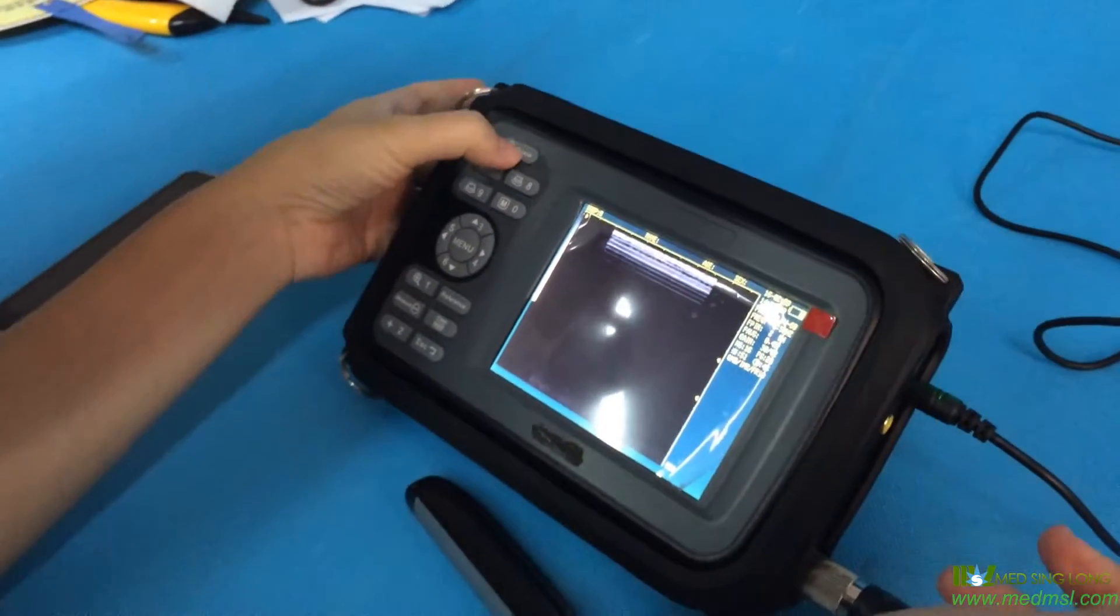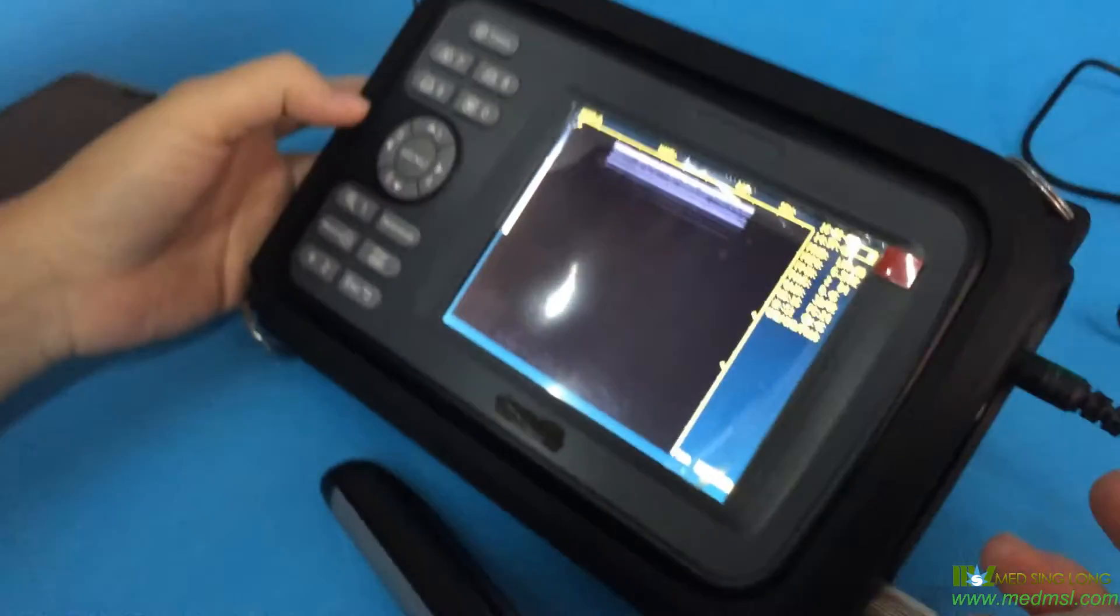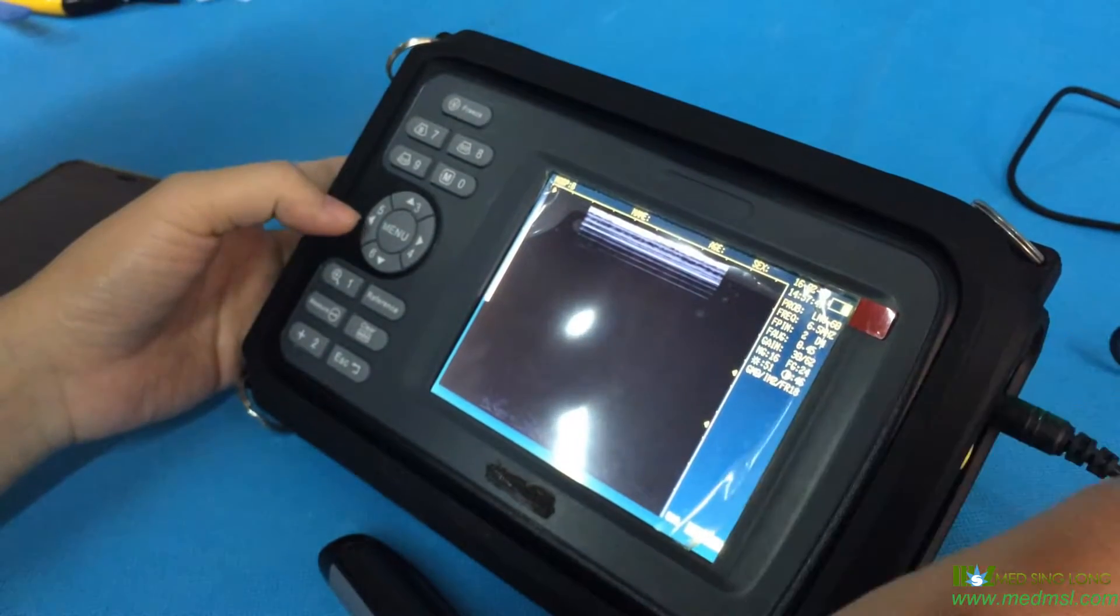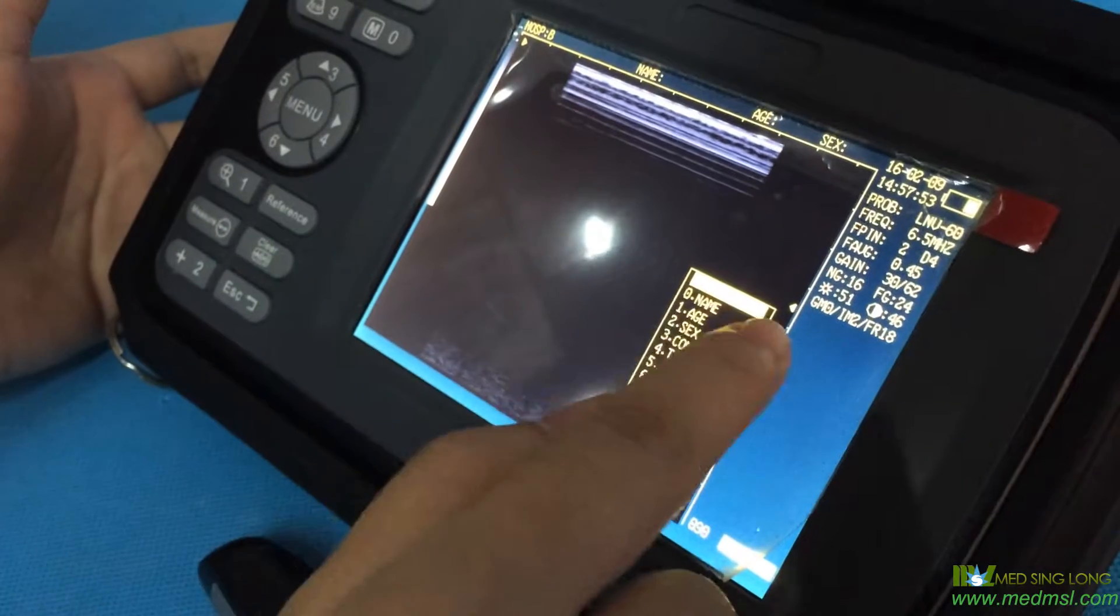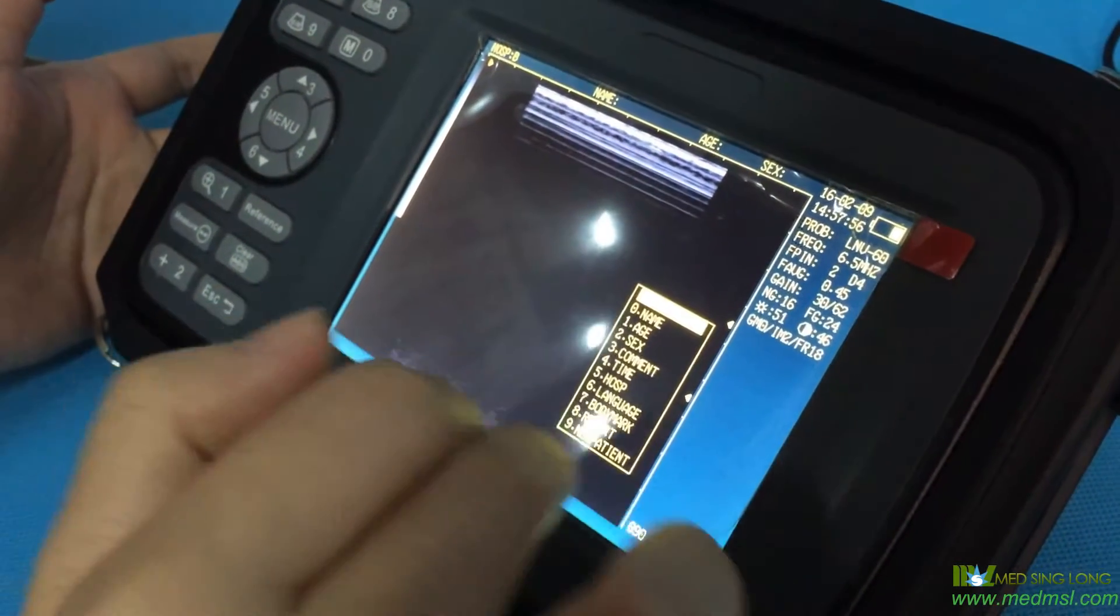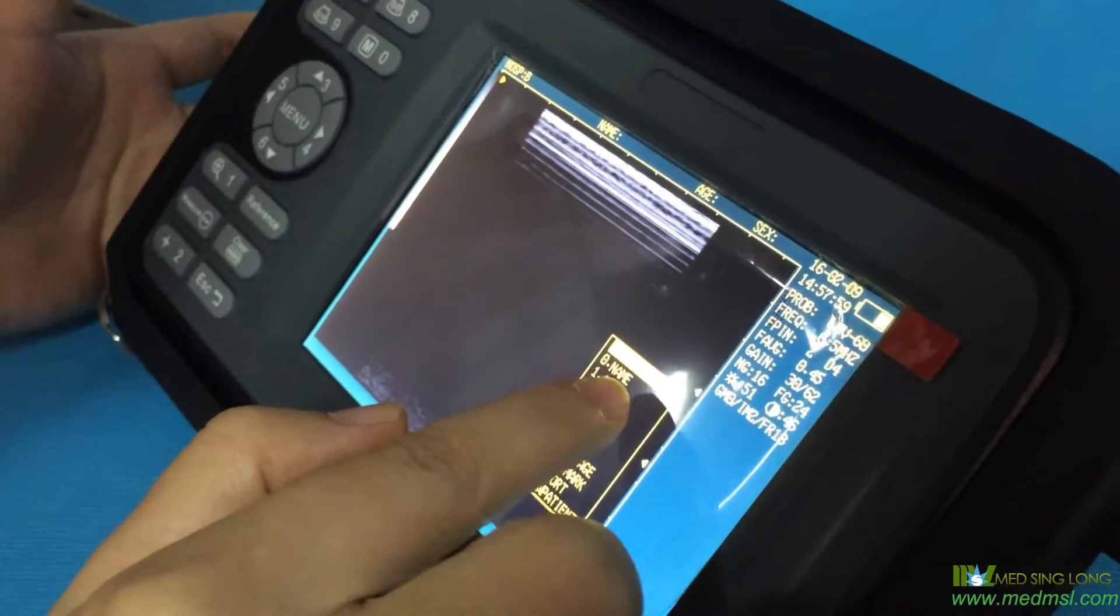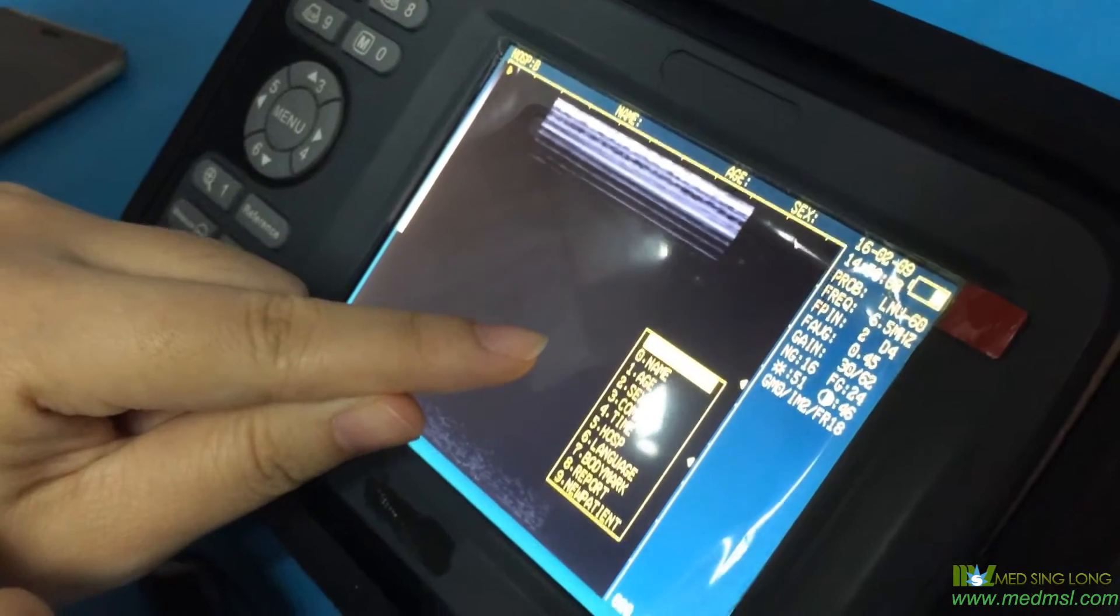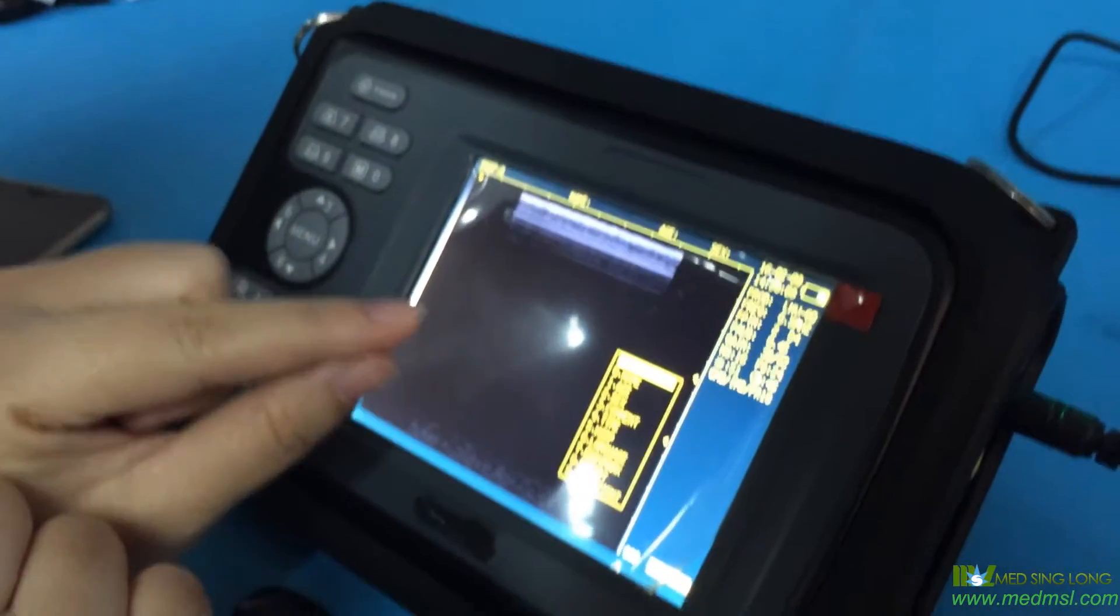Then we push the menu button again, and you can see there are many items on the screen. Zero is name, number one is age, number two is sex. If you want to write down the animal name, you need to push the zero button.